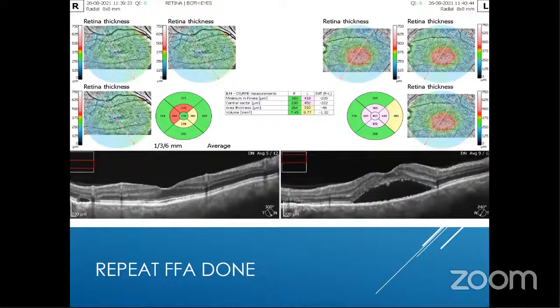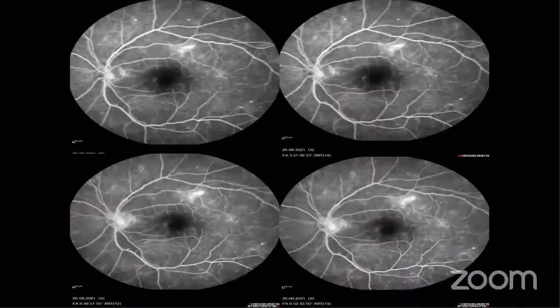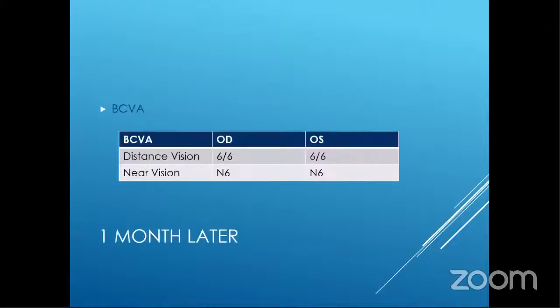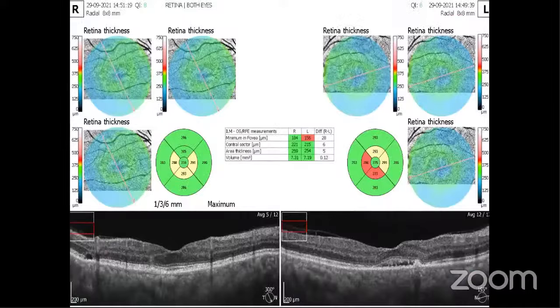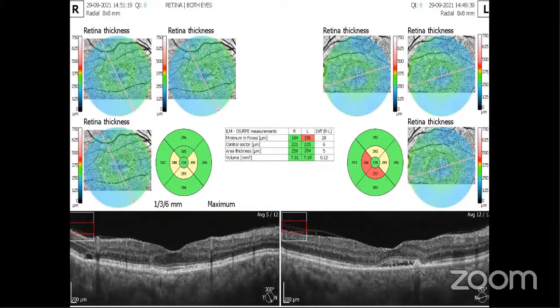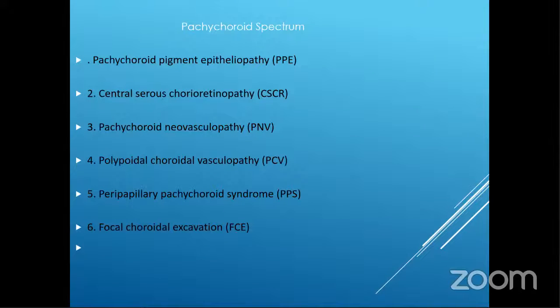Along with a few microaneurysm leaks consistent with mild non-proliferative diabetic retinopathy, this time we performed focal laser to the lesion along with an intravitreal ranibizumab injection. During follow-up at one month, he had good visual acuity recovery. This is the OCT picture, which shows very minimal residual subretinal fluid in the left eye. He is on continuous follow-up.